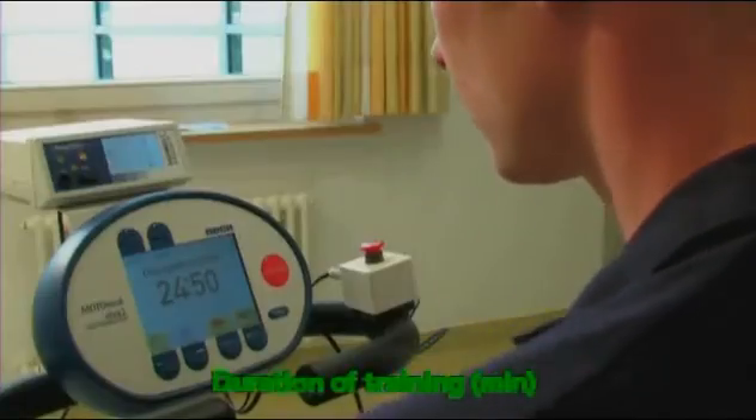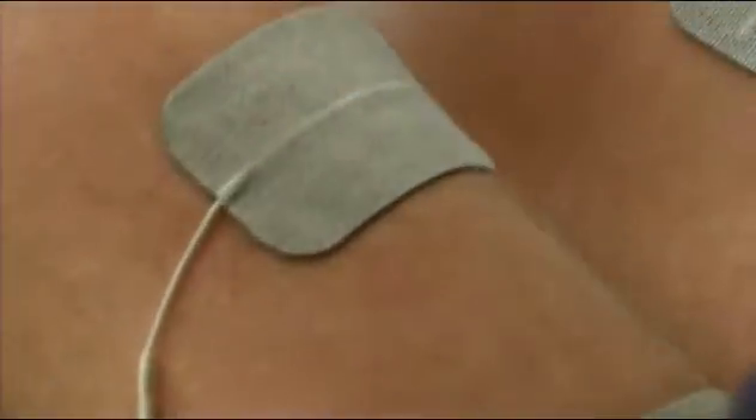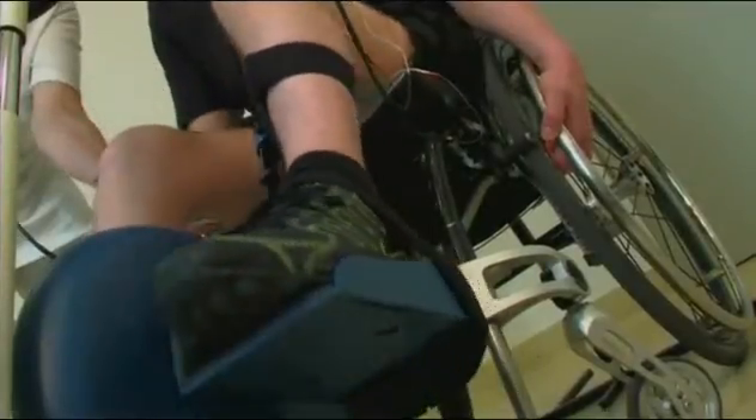As soon as the stimulation is active, electrical impulses activate the nerves that lead to the muscles. The muscles contract and an active cycling movement results. Active means that muscles can do useful work against resistance when normally paralysis would prevent this.